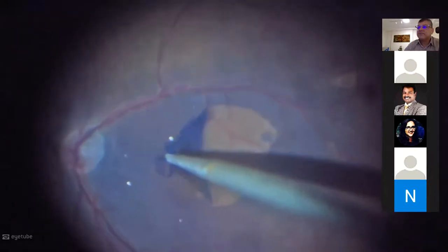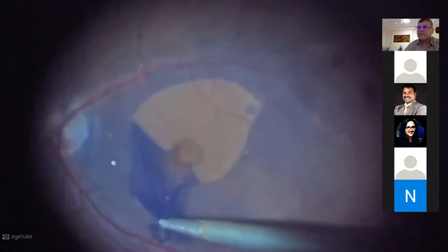Counterclockwise movement, lifting the internal limiting membrane and relieving all traction around the macular hole. I grabbed the edge of the ILM I just opened and went towards the optic nerve — it was already open, so I just followed. If you miss it, re-grab and start from where you lost the ILM. This internal limiting membrane came out very easily — a very good way to peel the membrane. Complete the peel, leaving a great part of the ILM intact.